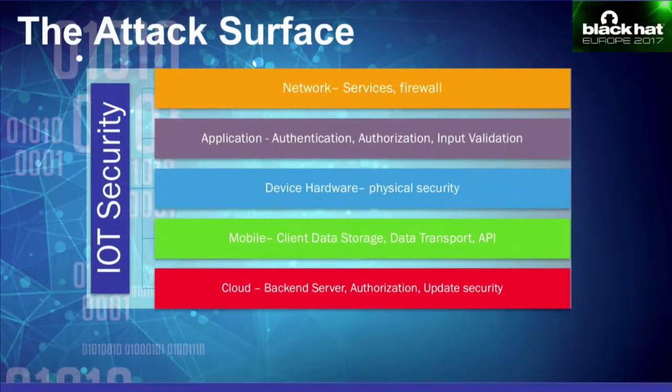Right, attack surface, I'll just quickly touch upon it. The IoT device could be as small as this device or a huge device, and they look like simple devices, but if you break it down, an IoT device would have a network layer, an application layer, probably a mobile interface, then there's the hardware itself, there's cloud infrastructure, so there's a whole support system.